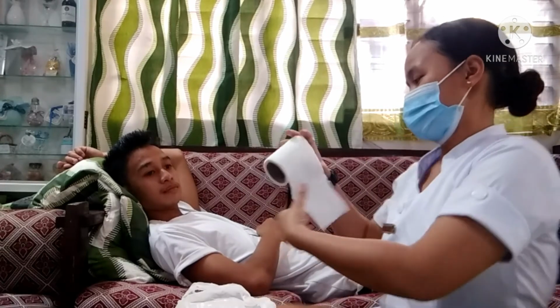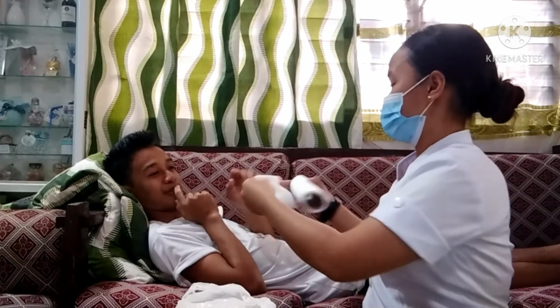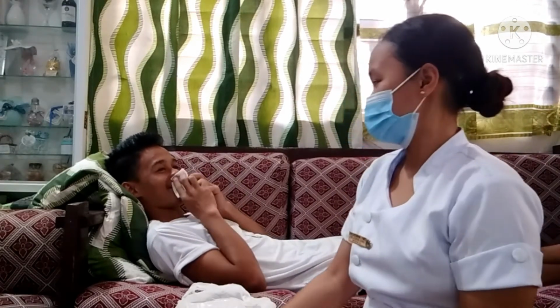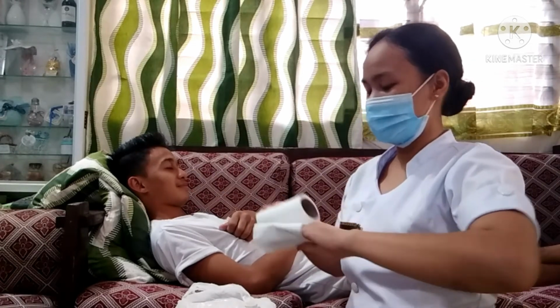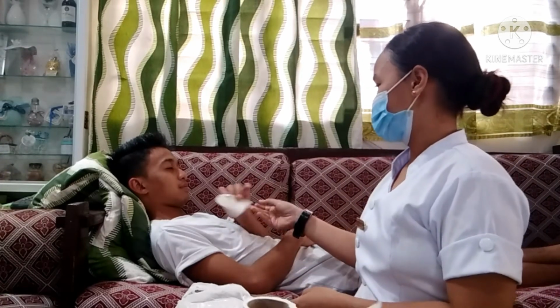Offer tissue to the patient and ask the patient to blow his or her nose. Sir, we have tissue here. Can you blow your nose first so that the nasal area will be clear? Then have another extra tissue in case the patient sneezes during the procedure. The blowing of the nose clears the nasal mucosa prior to medication administration.